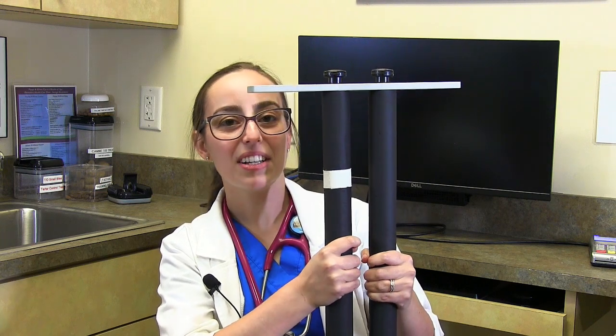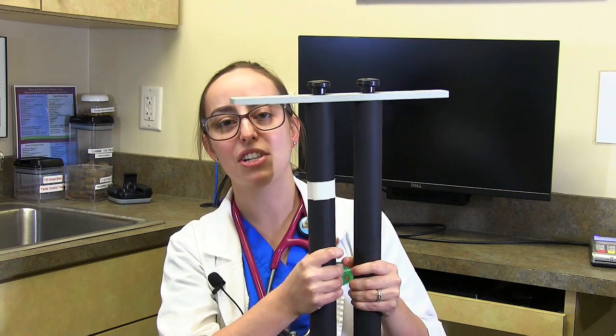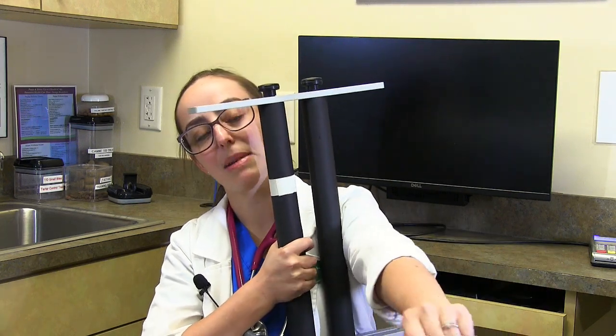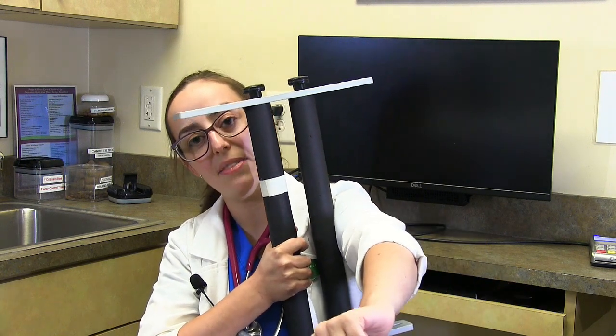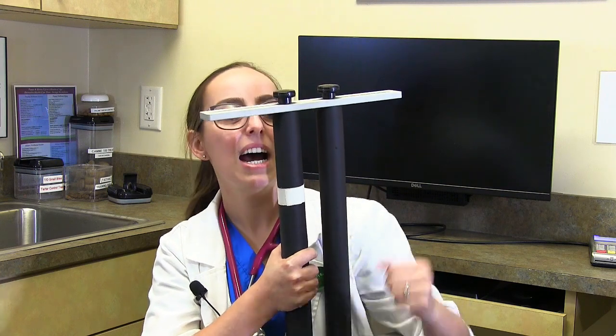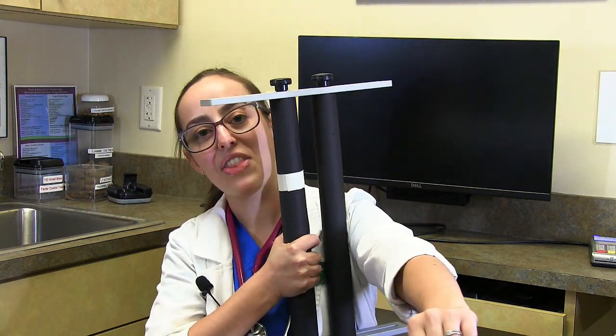You put it between the dog's legs along the pelvis and push the legs in — sort of like if I push against my shoulder, I'm moving my arm in. I'm not popping my shoulder out of the socket or anything dramatic, but it puts a little bit of pressure to the side on that joint.